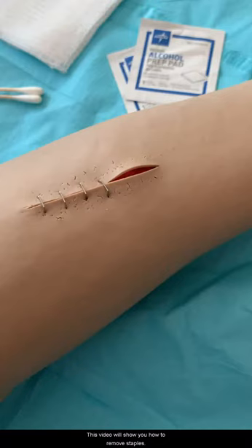This video will show you how to remove staples. Wash hands and assemble all needed items using sterile technique. Introduce yourself and identify the patient, and answer any questions.